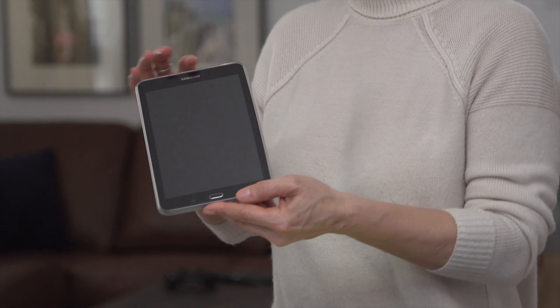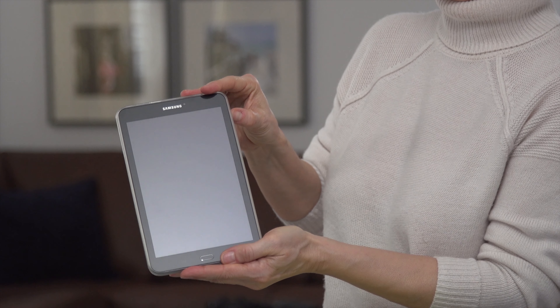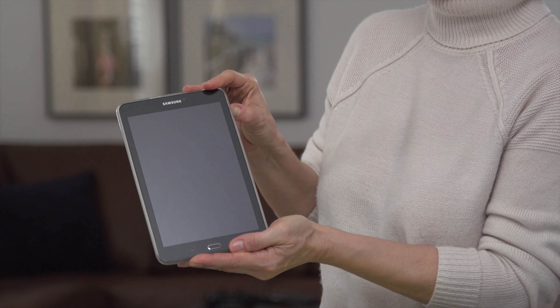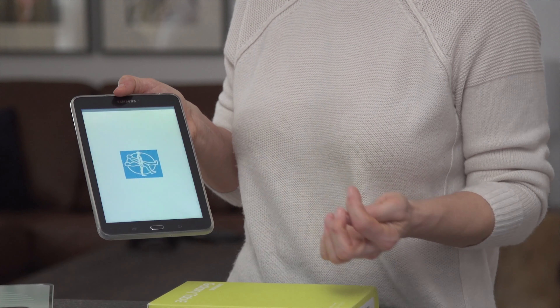Now that the tablet is charged, let's turn it on and log into NetResponse. To turn your tablet on, press firmly and hold down the power button until your tablet starts up. Because of the protective cover, you have to press pretty hard. This same button is used to turn off your tablet. Once the tablet is on, swipe the screen with your finger and you will see the NetResponse application on the main screen. This tablet can only be used with NetResponse. Tap the NetResponse icon with your finger to open it.